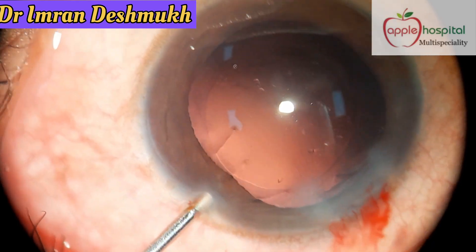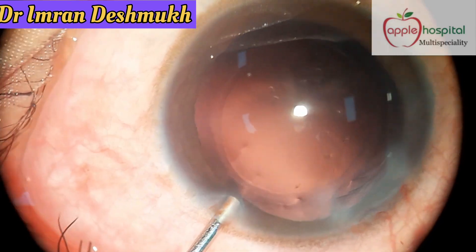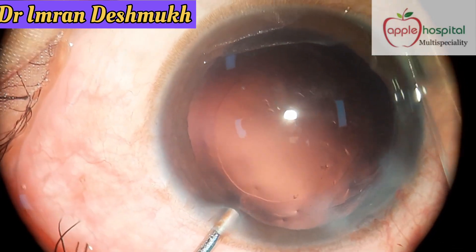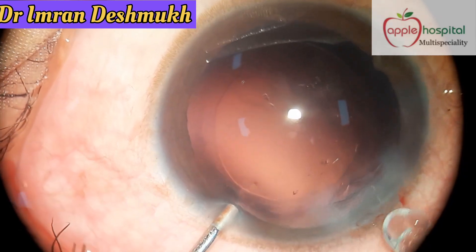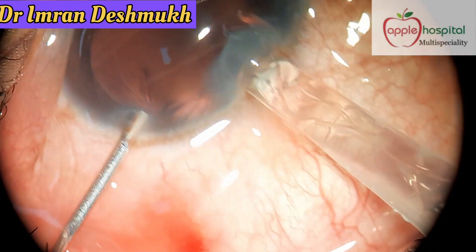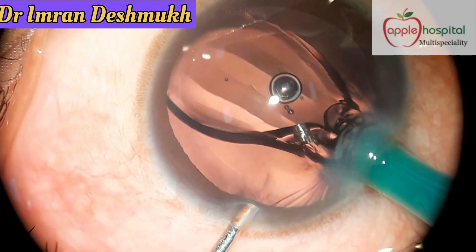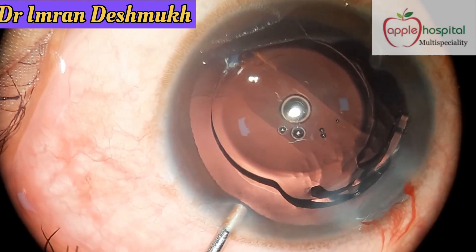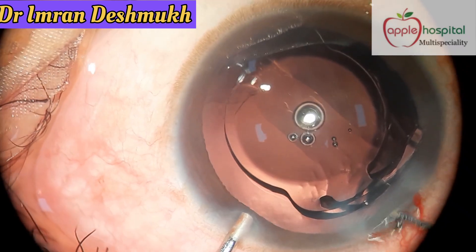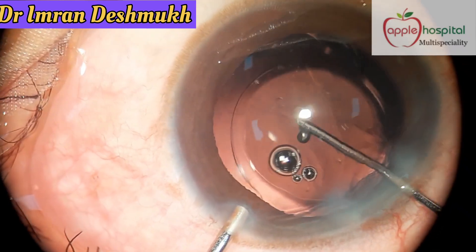Here is how it's done: take the irrigation port through the side port — you can either insert it directly into the AC or partially outside — and remove the excess visco from the cartridge. Now insert it through the main wound and inject the PCIOL in the bag. You can use your T pusher or Y pusher to push the IOL inside the bag.